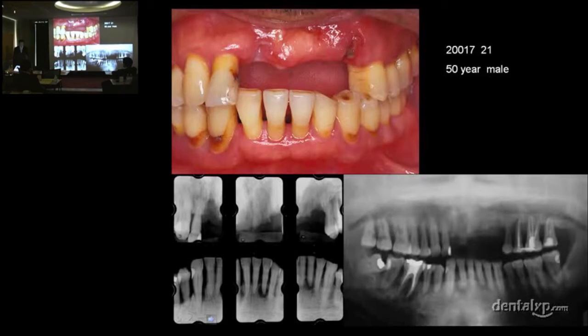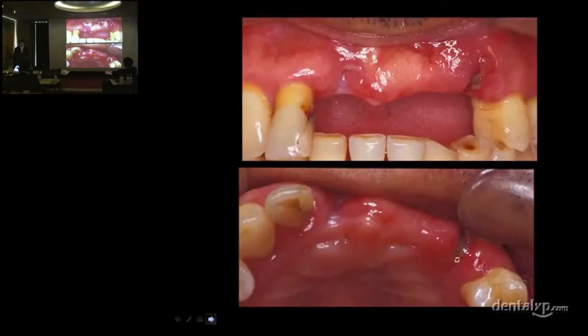This patient had advanced periodontal disease and severe bone loss. In the next slides, I will walk us through some of the steps involved in a complex multiple implant case, placing an emphasis on the timing of augmentation procedures. These photos show significant horizontal and vertical bone defects in the anterior region. Recently, tooth number 8 and number 11 were spontaneously lost.